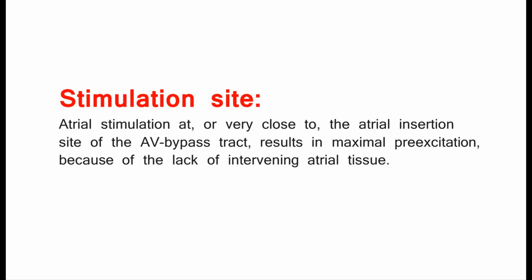Stimulation site. Atrial stimulation at, or very close to, the atrial insertion site of the AV bypass tract, results in maximal pre-excitation, because of the lack of intervening atrial tissue.